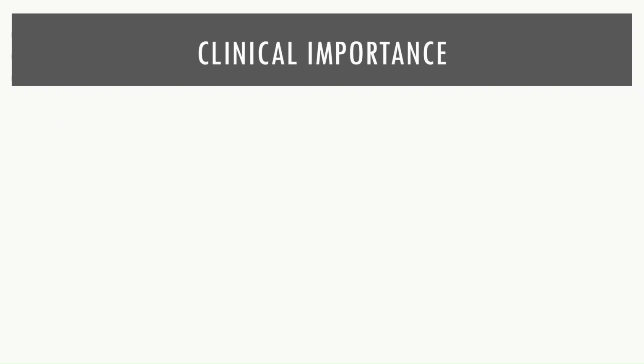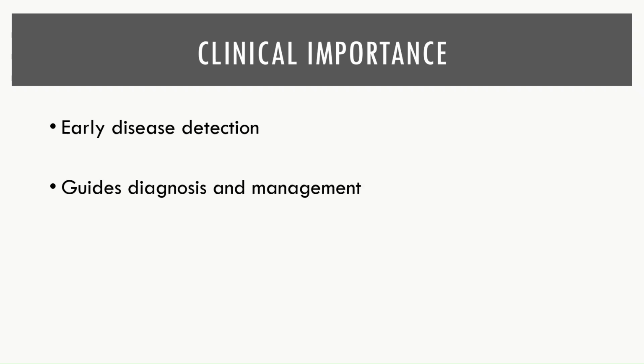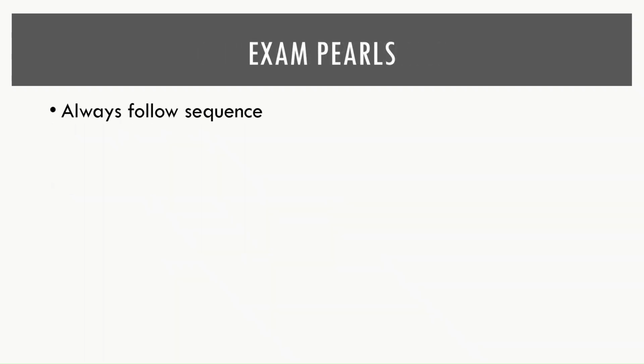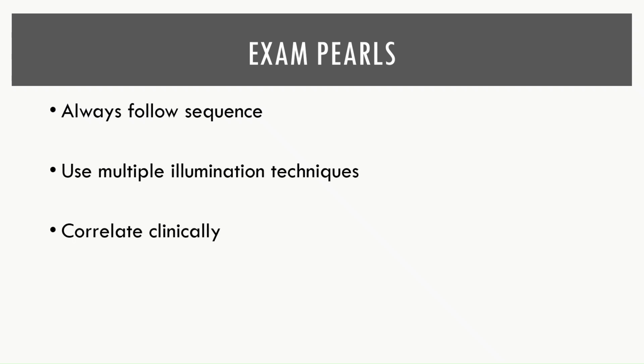Slit lamp biomicroscopy plays a crucial role in early diagnosis and management of anterior segment disorders like glaucoma, uveitis, and cataract. For exams, always mention a systematic approach, appropriate illumination techniques, and a clinical correlation.